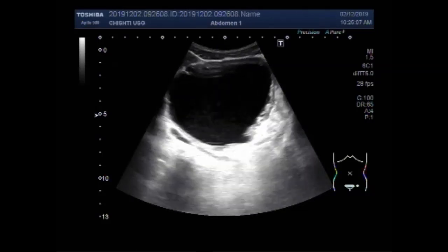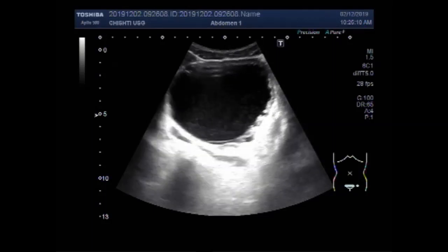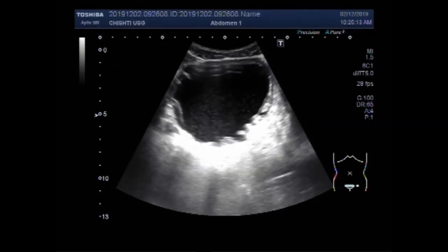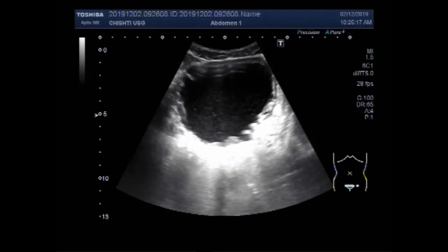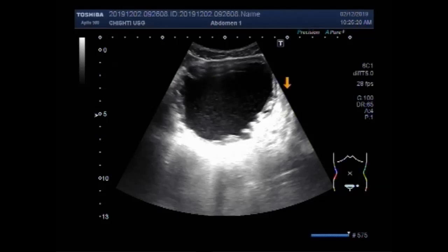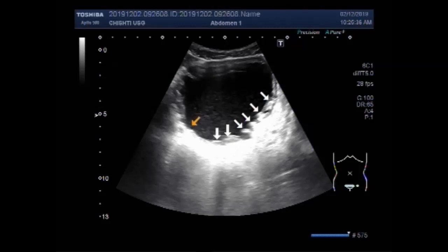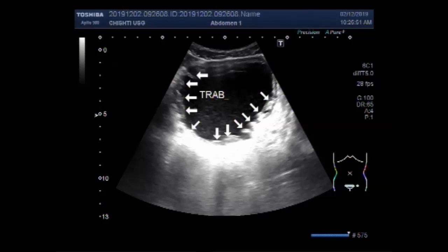Now you can see the trabeculated urinary bladder. Multiple trabeculi are seen on both sides of the walls of the urinary bladder and the base of the urinary bladder as well. You can see these trabeculations. These are the trabeculi.